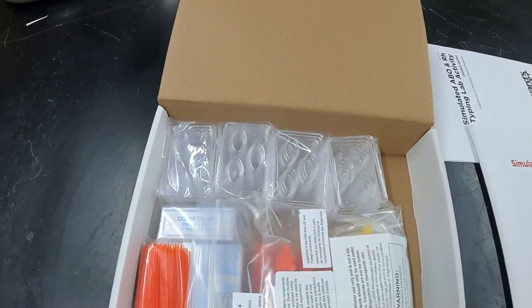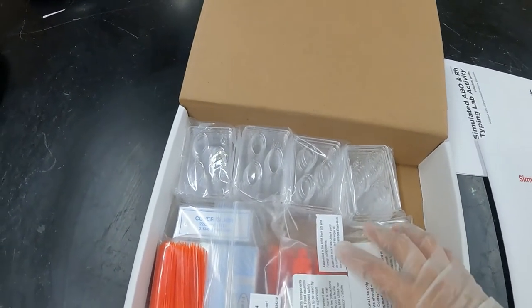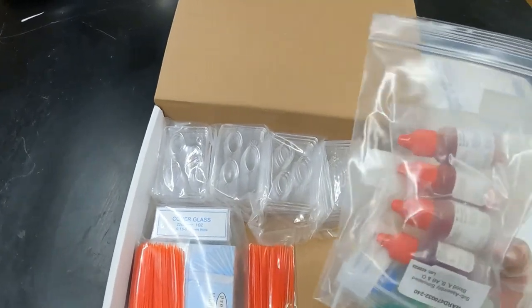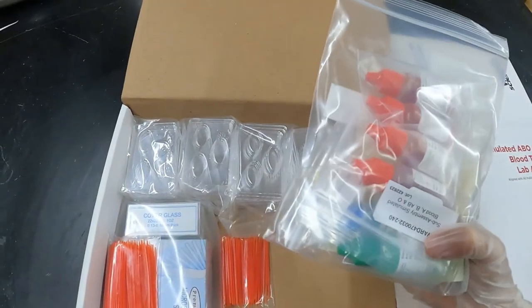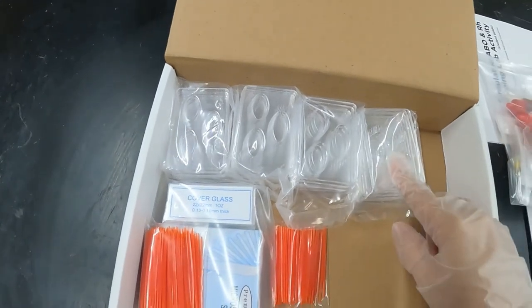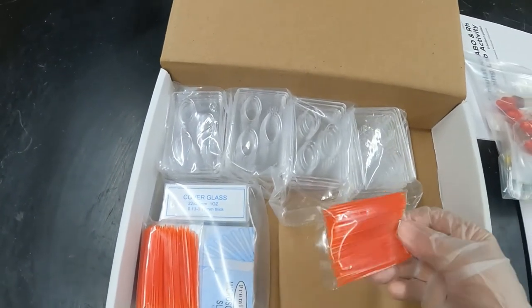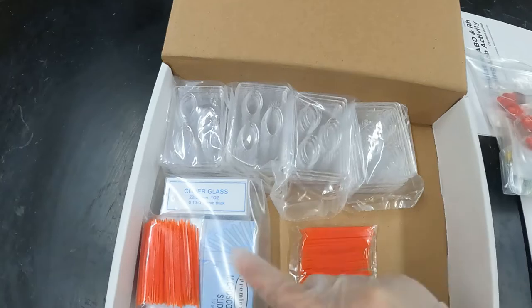In this particular one, we're going to be using the blood of two of the individuals that they have in here. So they have blood and they have anti-serum. They've got blood typing plates and they've also got some toothpicks to help you with the mixing and some microscope slides.